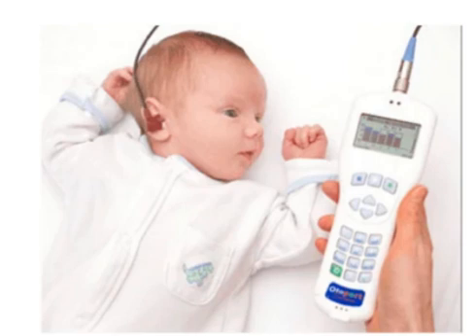Since OAE travel through the middle ear, they can also be affected by any middle ear disease, such as middle ear effusion. OAE may not be measurable in children with adhesive otitis even though the OHCs are healthy. Thus, OAE cannot distinguish between conductive hearing loss and sensory neural loss.